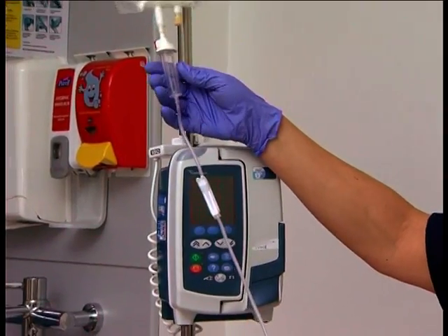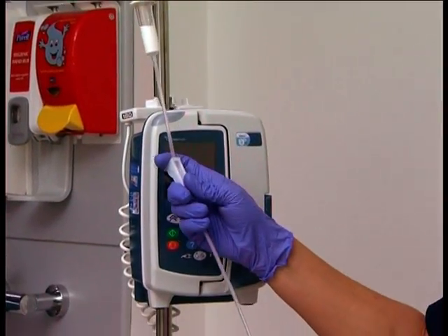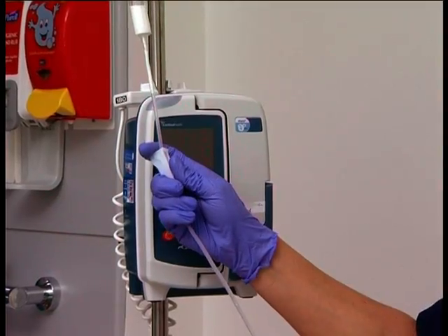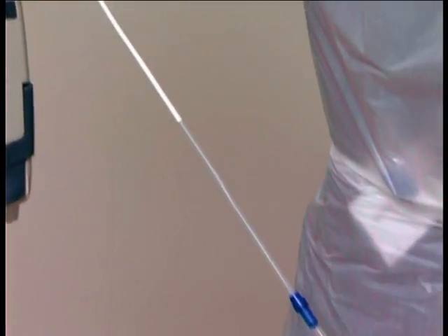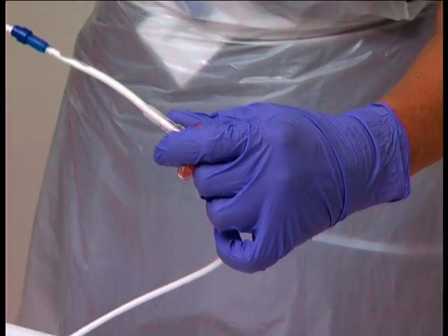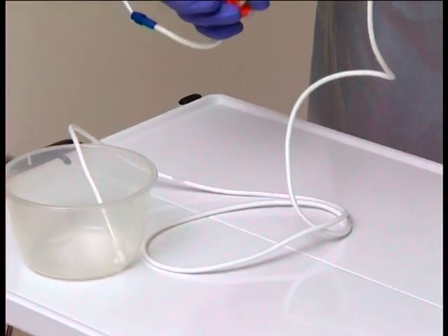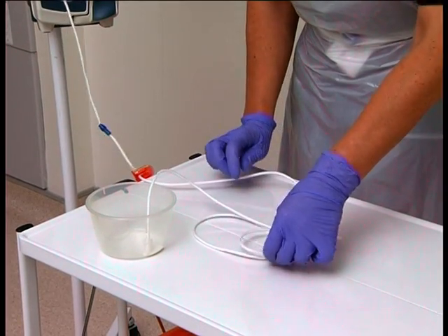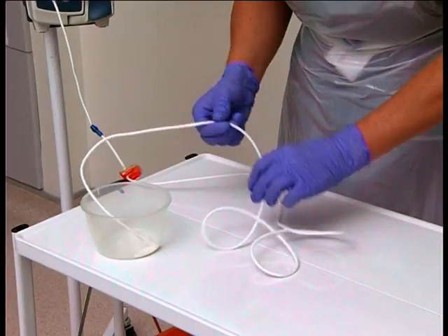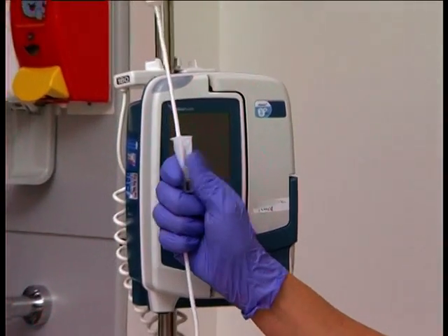Gently squeeze the giving set chamber until it is approximately half filled with fluid. Slowly release the roller clamp and allow the fluid to run through the giving set. Expel any air by allowing it to run upwards in the direction that the fluid is travelling. Once all of the air is removed and the giving set is fully primed, close the roller clamp.